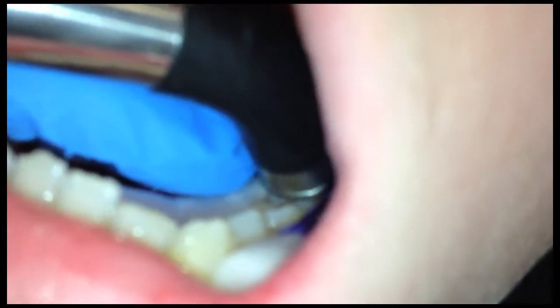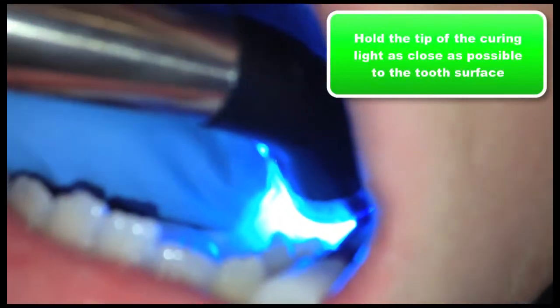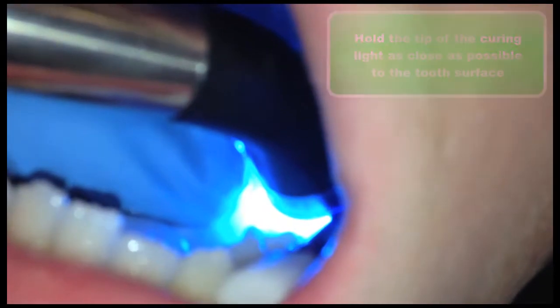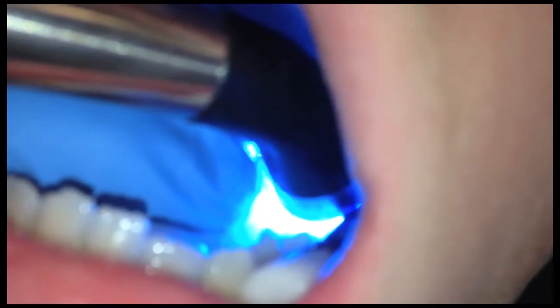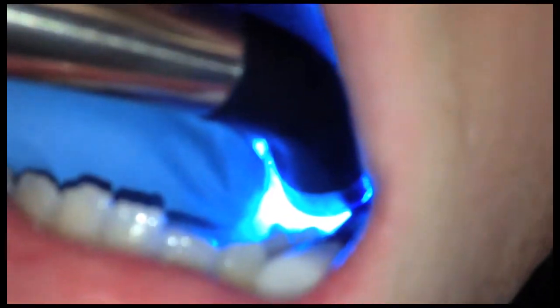Now it is time to light cure the sealant. Hold the tip of the curing light as close as possible to the tooth surface. Curing time is 20 seconds, but an additional 10 seconds or 2 20-second cycles is recommended for each surface. Remember, you cannot over-cure a sealant.